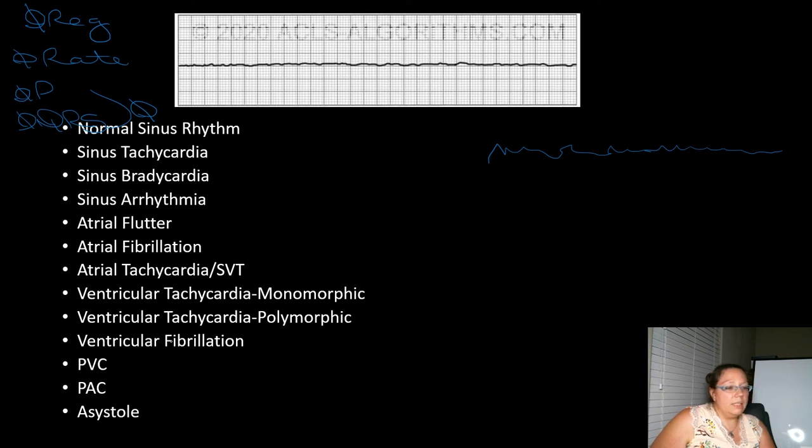One thing, if you're on a monitor, increase the size of your cardiac rhythm, the lead size, and you'll be able to see the actual fibrillation. It won't curve like that, but it'll look like fibrillation, not fine like this. So what is this? VFib. What do you do with VFib? You shock them. Shock them right away. VFib, DFib. Get that heart slapped across the face.